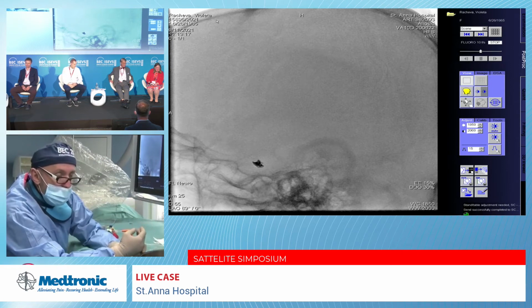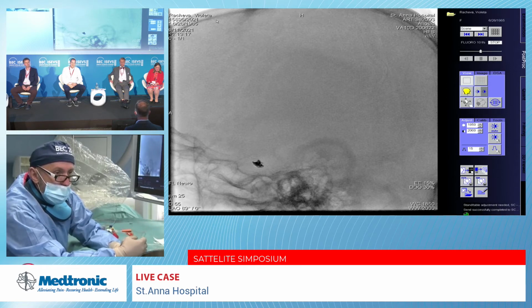Can I ask one more question to the operator? Your experience with intrasaccular flow diverters, like the WEB, devices directly within the aneurysm, does that play a big role? Do you go for conventional coiling with stent assistance and flow diverter, or what is your practice using devices within the aneurysm?